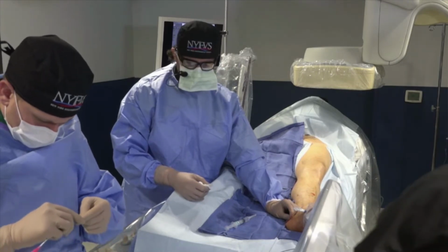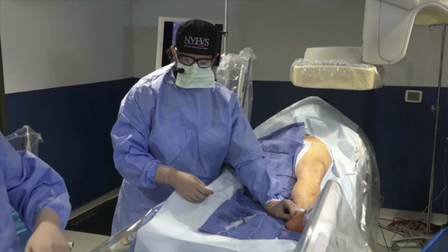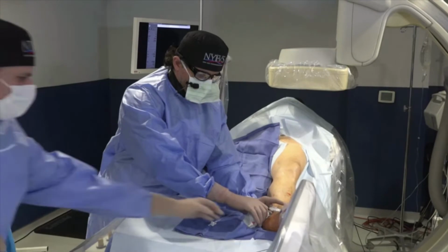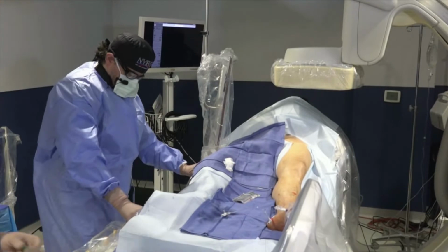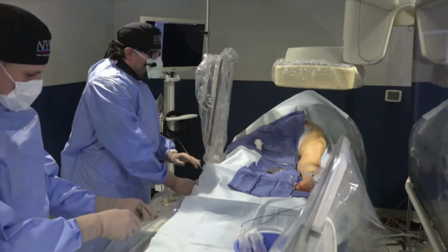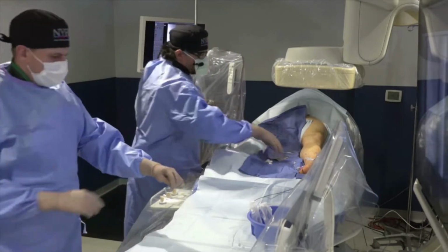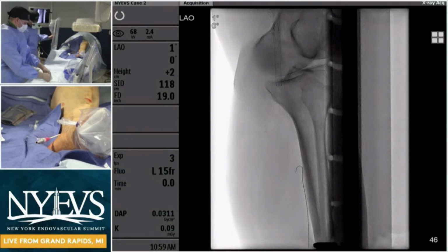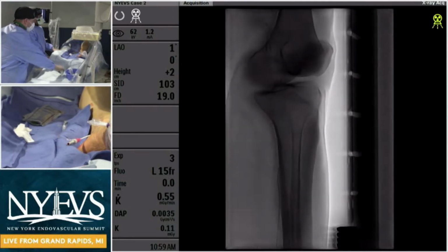Fadi, you know it's me, brother. Oh, my God. So I think primary pedal approach is reasonable here, but I would have probably gone just like Dr. Snyder said, up and over, done it from above, only because it looks like a fem-TPT bypass graft. And the lesion is right at the TP trunk. So now if you are treating it, you have to treat the PT and probably go up and over, treat the peroneal also because the disease progresses into the peroneal. So you're ballooning across the TP trunk. Again, that's basically your anastomotic zone. So I would have probably done up and over, but again, approach is totally reasonable.